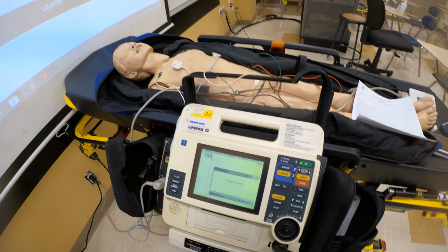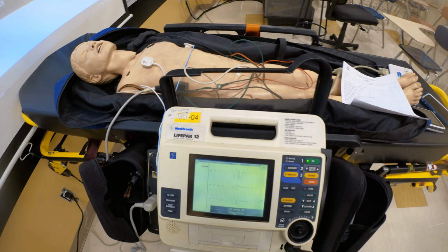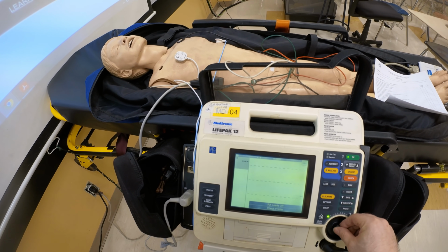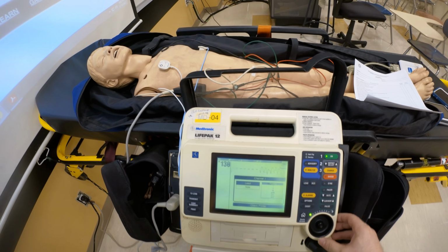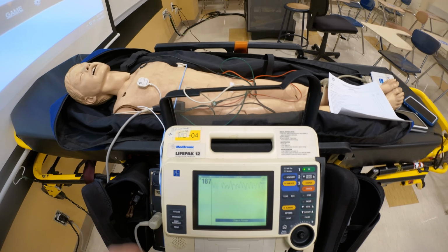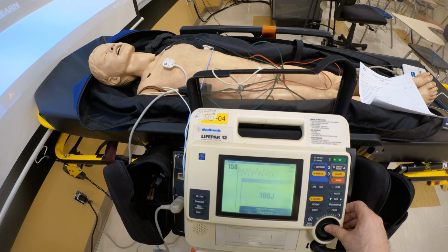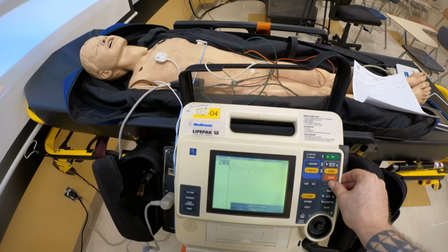Now, sometimes students come in and they only put the pads, the quick look pads, and you notice all of a sudden I do not see anything. Sometimes what the students may do is go here and put paddles, so the paddles are displayed. Now I want to go ahead and perform my therapies. So I select my energy, it's 100, I put it on sync, and what happens? It's not letting me do anything.